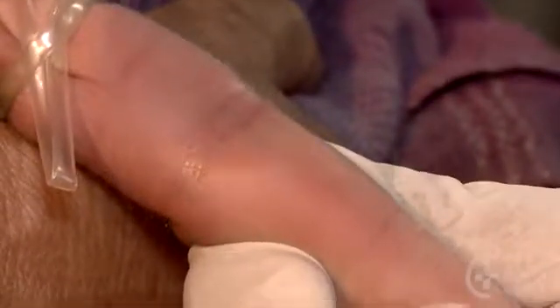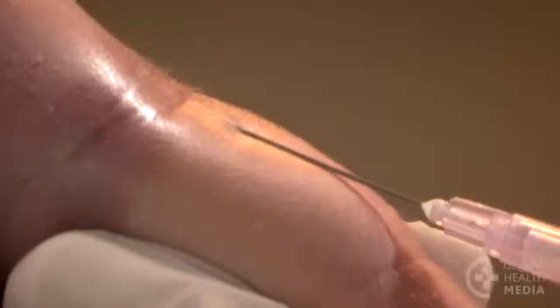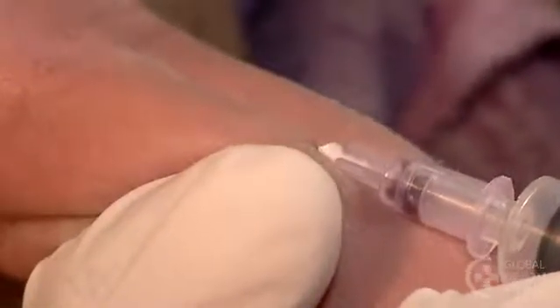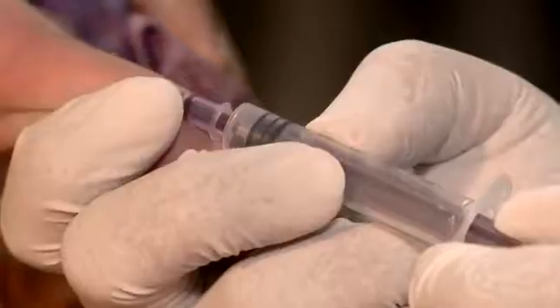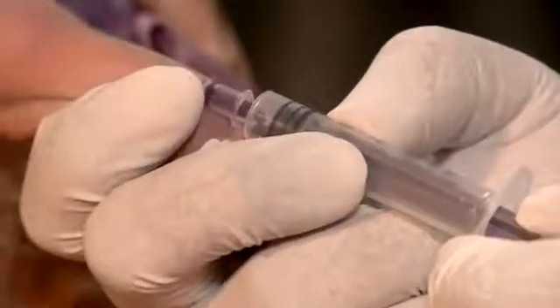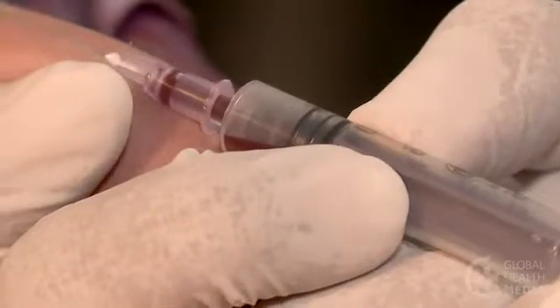Stretch the skin and hold it firmly. Now, insert the needle through the skin. The flashback of blood shows that you're in the vein. Pull back very slightly on the syringe and then continue to hold. Let the syringe slowly fill.